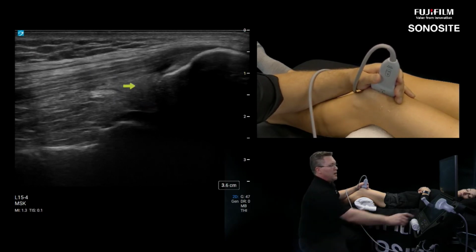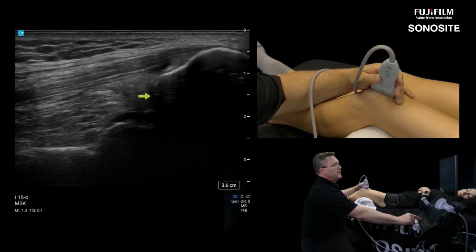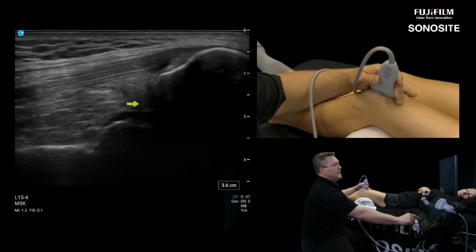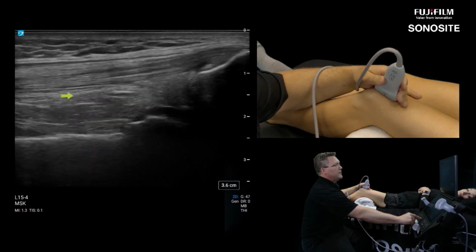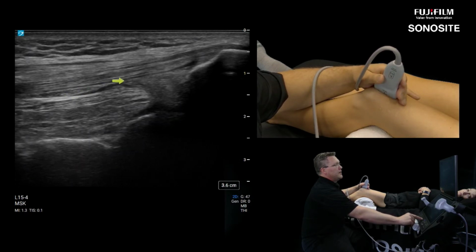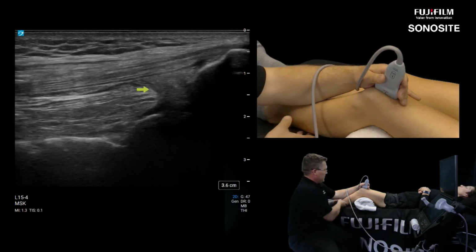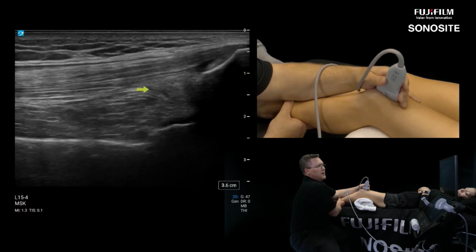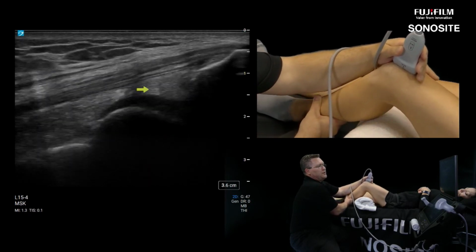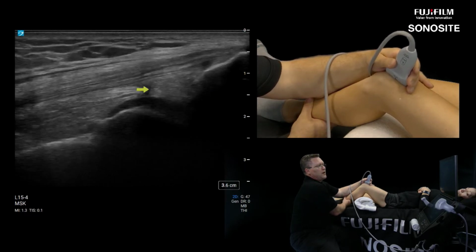So here I can tell this is prefemoral fat. This is the quadriceps fat, this little triangle here. And then check out this sliver of a hypoechoic line right there as it climbs up proximally underneath the quadriceps tendon here. This is the suprapatellar recess. And we can tell that dynamically just by doing more passive flexion and extension right there. I'm getting those two fat pads to oppose each other, okay? So right there, we even force a small triangular wedge of joint effusion.